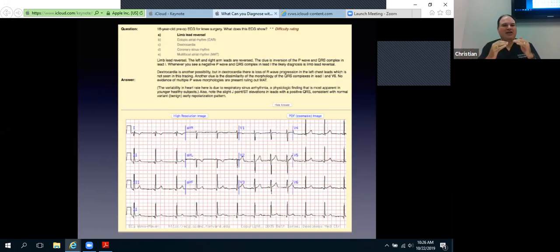That basic issue of being able to recognize somebody who's in A flutter, and they're having palpitations, they're not feeling right, you haven't done an echo yet or looked at them. A lot of these patients, you're not going to do echoes. You can't echo everybody. We just don't have time to do it. But you can suddenly realize, okay, this person's in A flutter. They need to either get cardioverted or anticoagulated and cardioverted later.